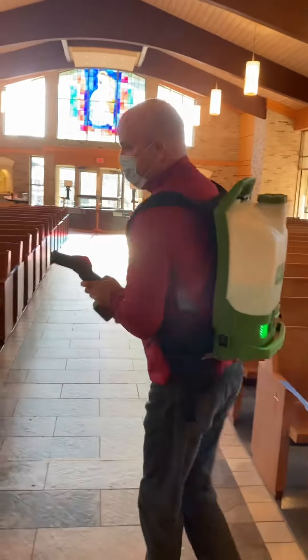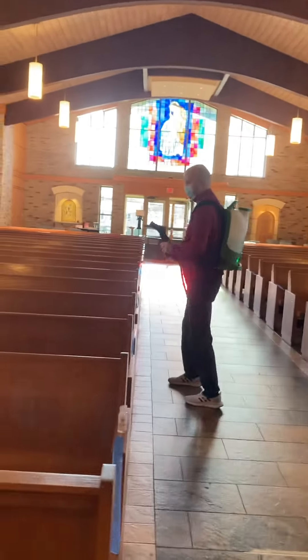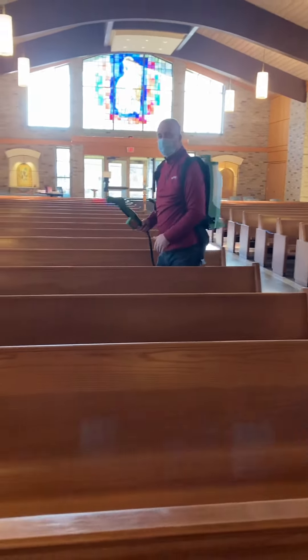So what you do is you walk down the pew, and one key thing is to make sure that the pew is all set — the kneelers are up.